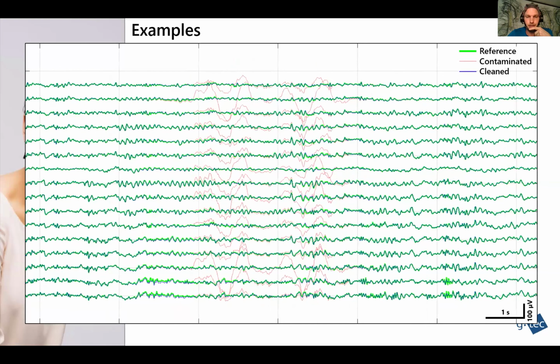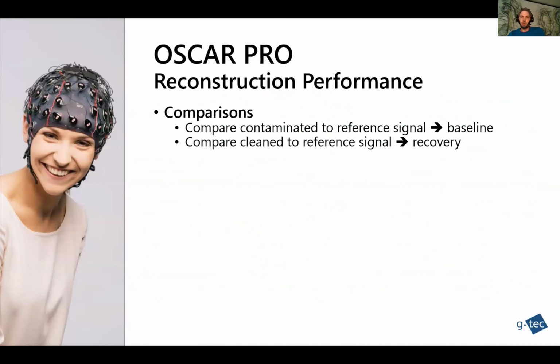And also here, we have the same structure. We have a reference signal in green, contaminated in red, and cleaned in blue, even with some alpha on it. But the artifact is removed while the alpha here, for example, is preserved. So again, we see visually a nice reconstruction of the underlying reference signal. So how did we put that into numbers?